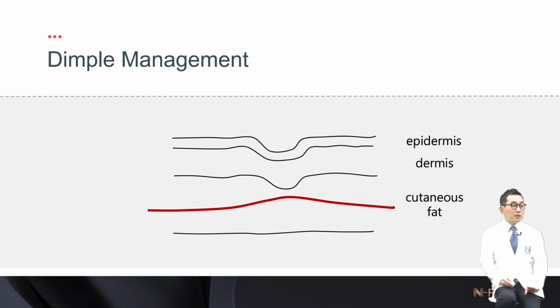When doing subcision, depth is important. Of course, you have to go between the thread and dermis. If you only know these principles, you don't have to be so scared about dimple.